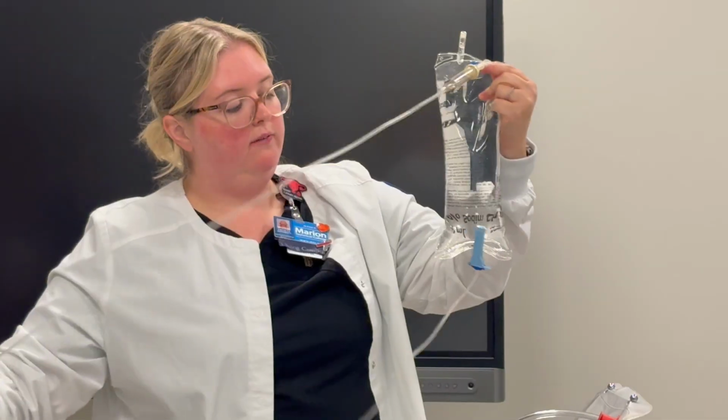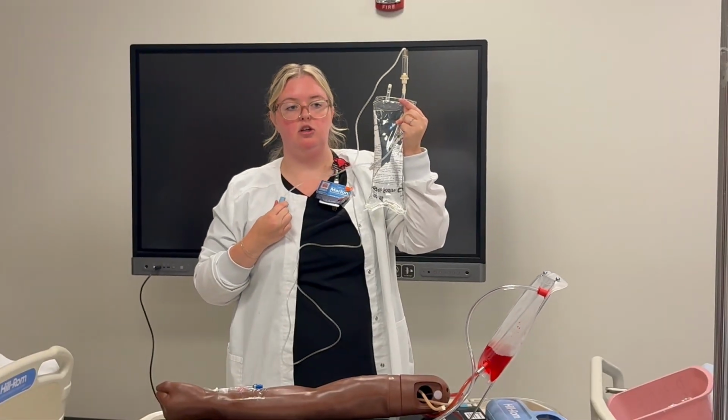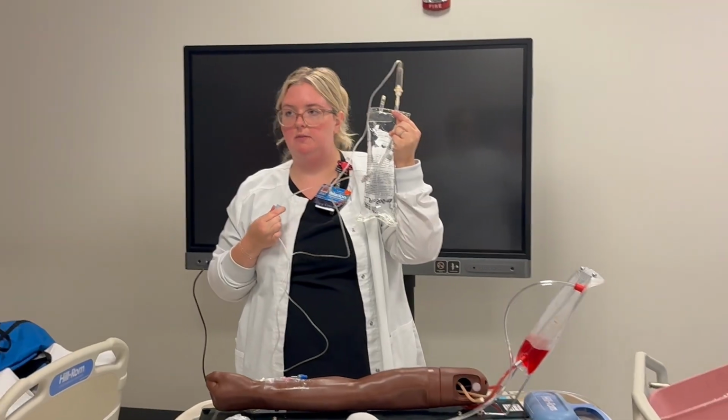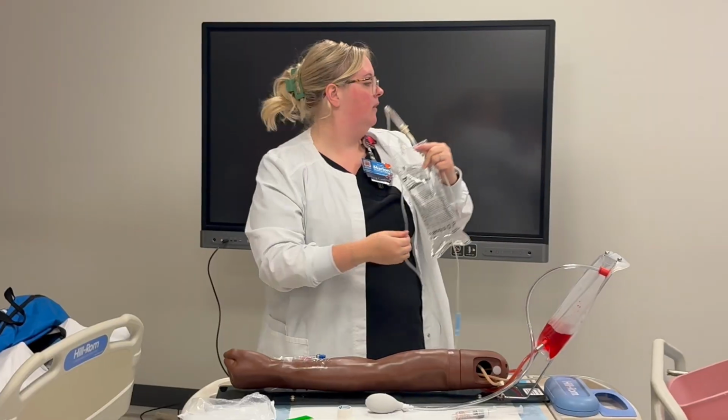Another thing too, the first time you open tubing, get in the habit, you want to clamp, or else you're gonna turn this over and it's gonna start flowing and you're not gonna be ready for it. So we clamp with the roller clamp, okay?